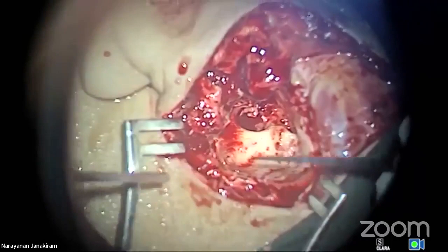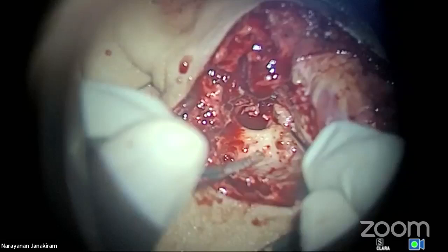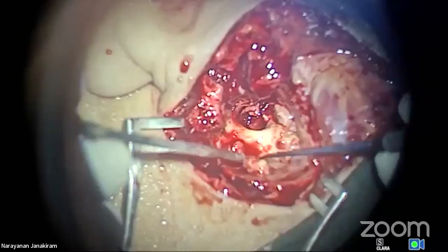Now this will go into the perilabyrinthine cell. See that? Can you see? Clearly seen. Okay, come on. The next will go into the tip cell. See that? Can you see that? So you will not have a dumping effect. So the third will go into the sinodural angle. Can you see here? All of you?